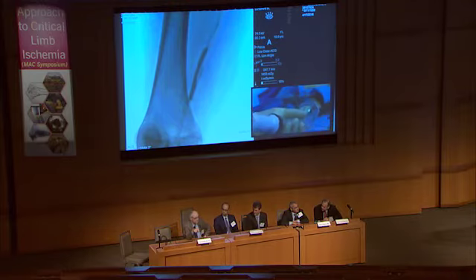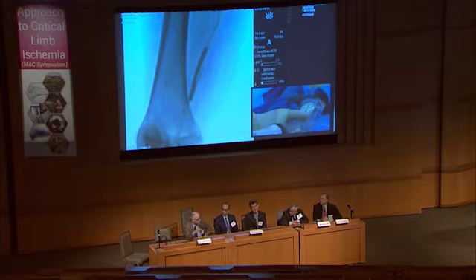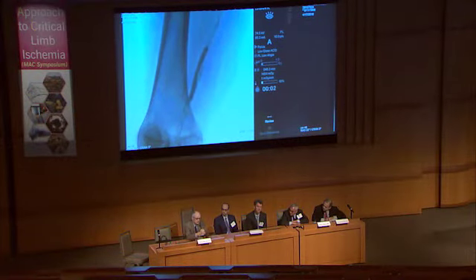Well, my concern here is this is a situation after surgical reconstruction, and it could be an area of patchplasty even, so that this is a very big origin, or a bigger diameter of the origin, and it could be that this is all thrombus causing residual stenosis. So if you would use a stent, you should use a very large stent, at least 8 or 9 millimeters in dimension, to really cover the true dimension of the origin of the SFA.